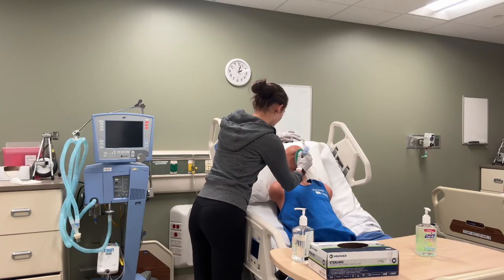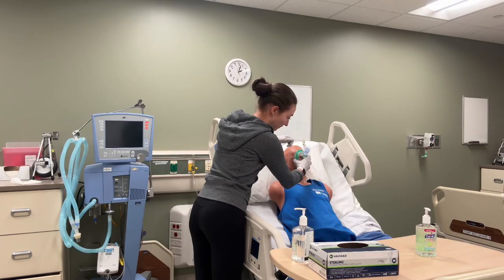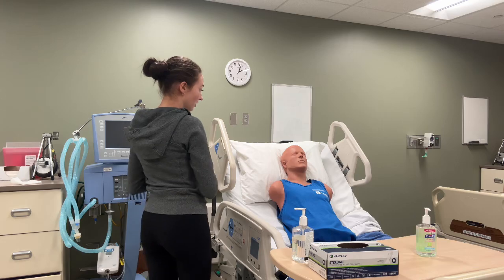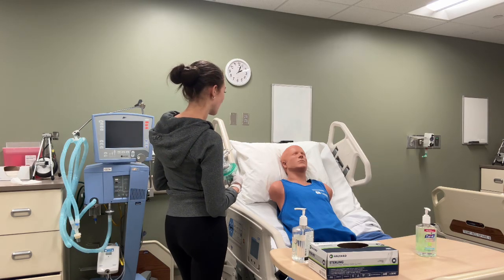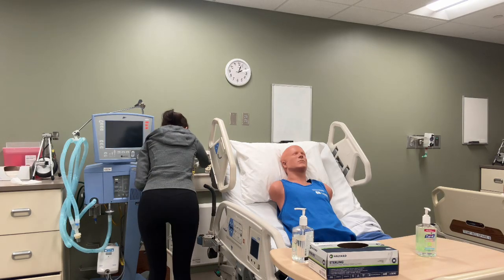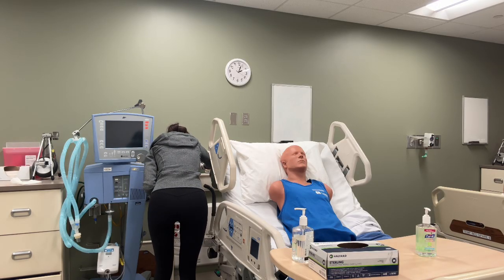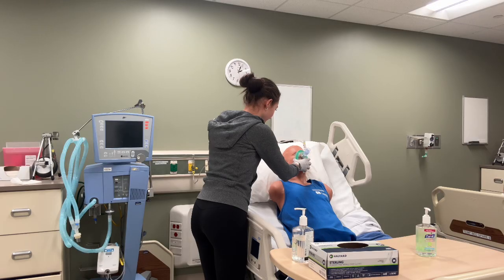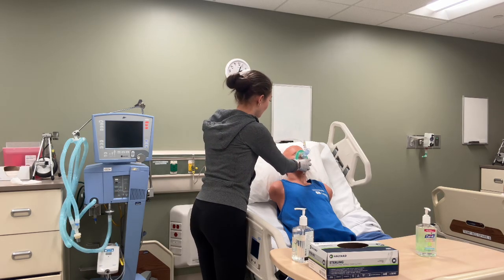Sorry if I'm applying some pressure. Perfect — you're doing your diaphragmatic breathing. Now I'm going to increase the pressure. In between each set of 10 to 20 breaths, I'm going to have you do some huff coughs like we did before. I'm going to increase it up to 10. And you seem like you're getting good pressures between 10 and 20 centimeters of water pressure. That's perfect.